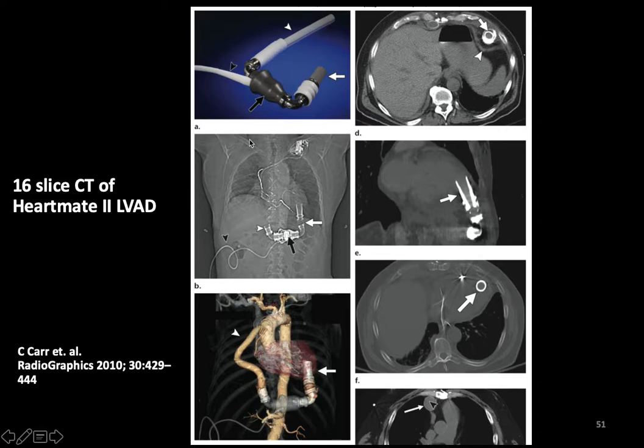The other thing you can do is a more wholesale fitting of devices. So LVADs are left ventricular assist devices. These are pumps that pump for you. So the idea is that you're going to implant this into the left ventricle and suck blood out, and through a continuous flow pump it right back into the aorta. And so someone can go from having a pulse to being pulseless and having kind of steady state flow.